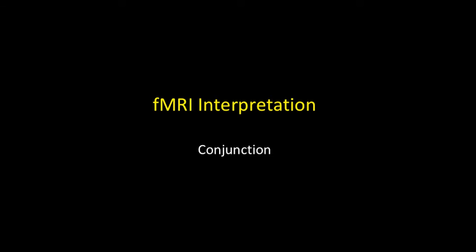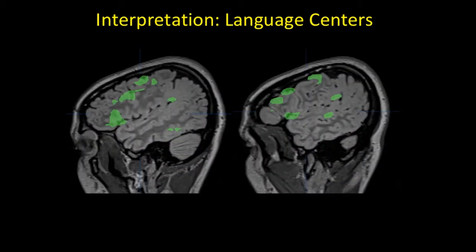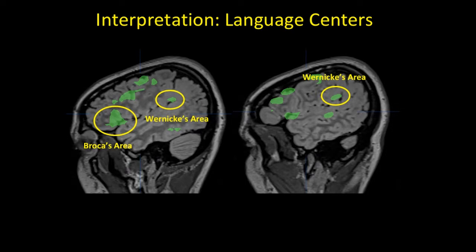The interpretation is pretty straightforward in this case — we have left language lateralization. A good hint: about 80 to 85% of the time, the language part of the SMA or pre-SMA is on the same side as the language dominant hemisphere, and here it's circled on the left. We can see pretty confidently our language centers — Broca's area and Wernicke's area in the cortical dysplasia — so we want to stay away from that in our report. We also see a well-defined posterior superior temporal sulcus association language center.